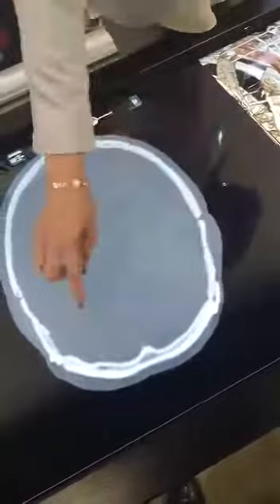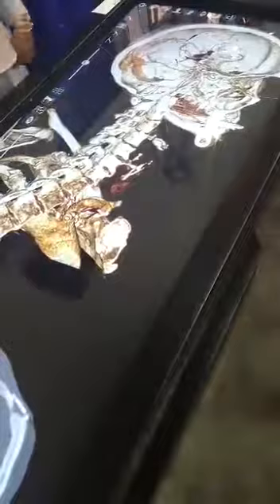What's most interesting to me is you can load in your own patient's CT or MRI scans, and from there you can get a 3D model of what you're seeing. So here we have a post-operative scan of a patient with a brain aneurysm, and this is the actual CT that was provided. You can go ahead and slide through the CT and see exactly where the clips were placed as well. It's more intuitive when you see something in 3D where the clips were placed rather than just focusing on a CT.